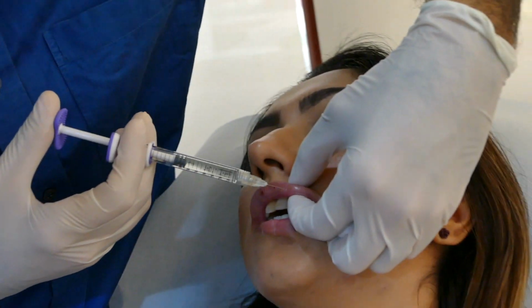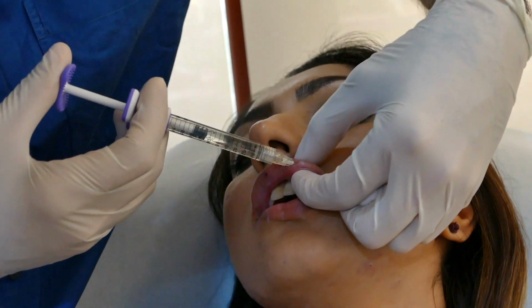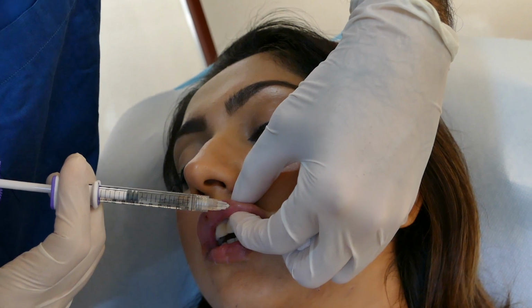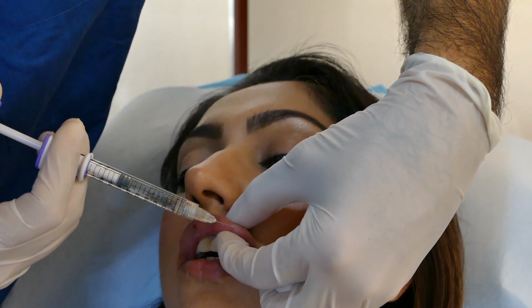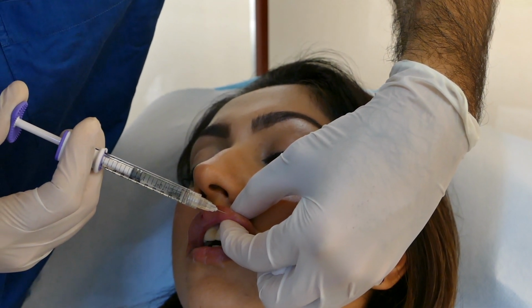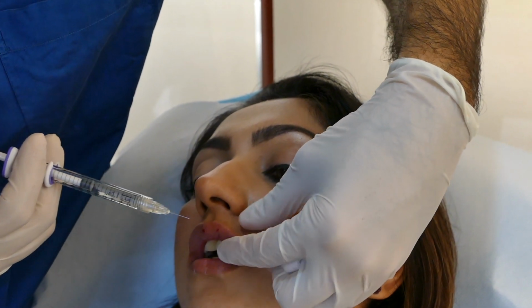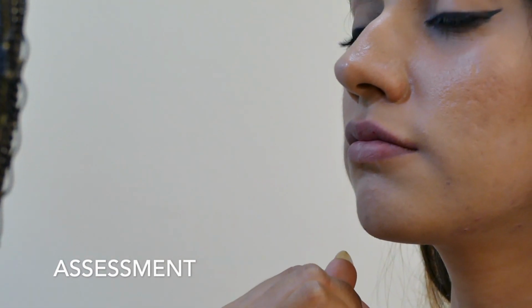After completing the upper lip, assess by asking the patient to sit up, show her the mirror so she can see the changes, and explain to her what you may further do to increase the volume. This will ensure that the patient does not suddenly see an enlarged lip which she may or may not like. Of course, people have different perceptions of beauty, but it's not even 1 to 1.6 right now. It's almost 1:2, so I can still add a little more volume in the upper lip.